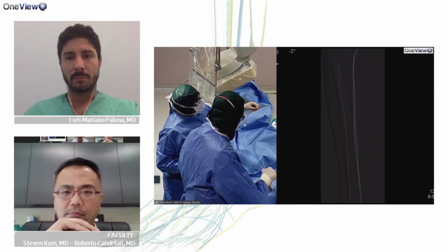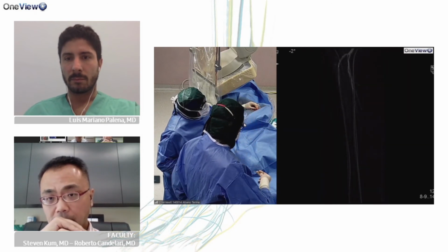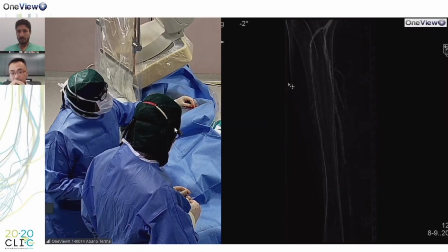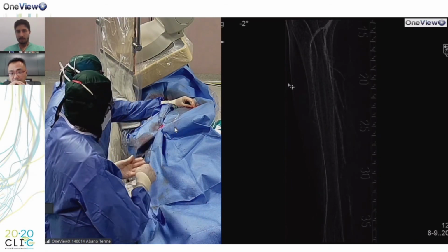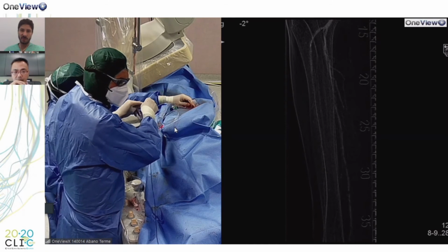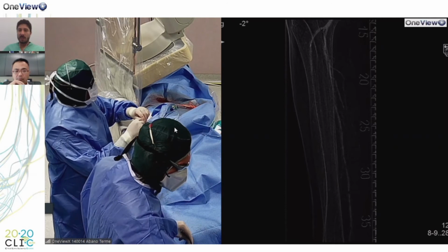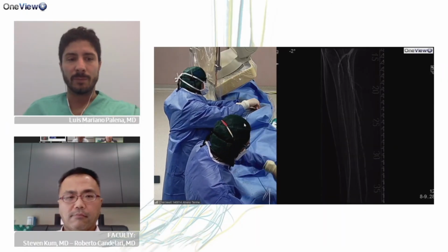Yes, the artery seems to be open now. There is a little bit of flow. Now we try to remove something more with Jet Stream. Well, yes, you still have the guide wire in, so for sure there is much more flow inside this vessel. I think it's a nice job till this point. If you agree, let's continue with Roberto's presentation about IVUS, and in 10 minutes we will be back to you. Thank you. Okay. Please, Roberto.